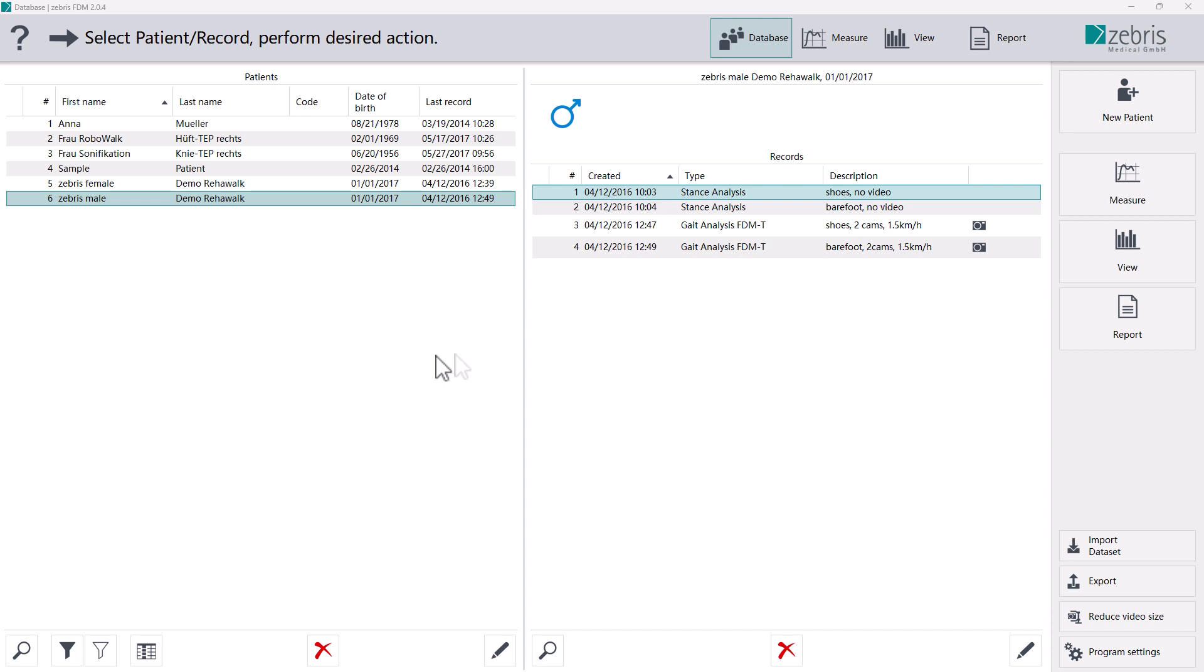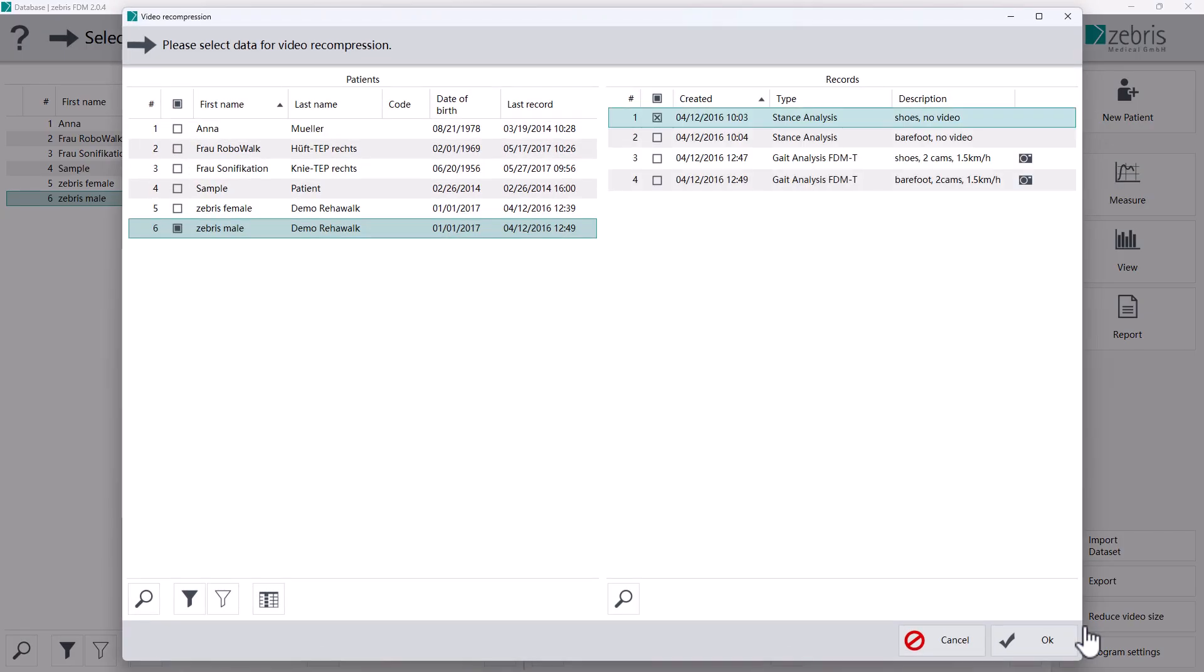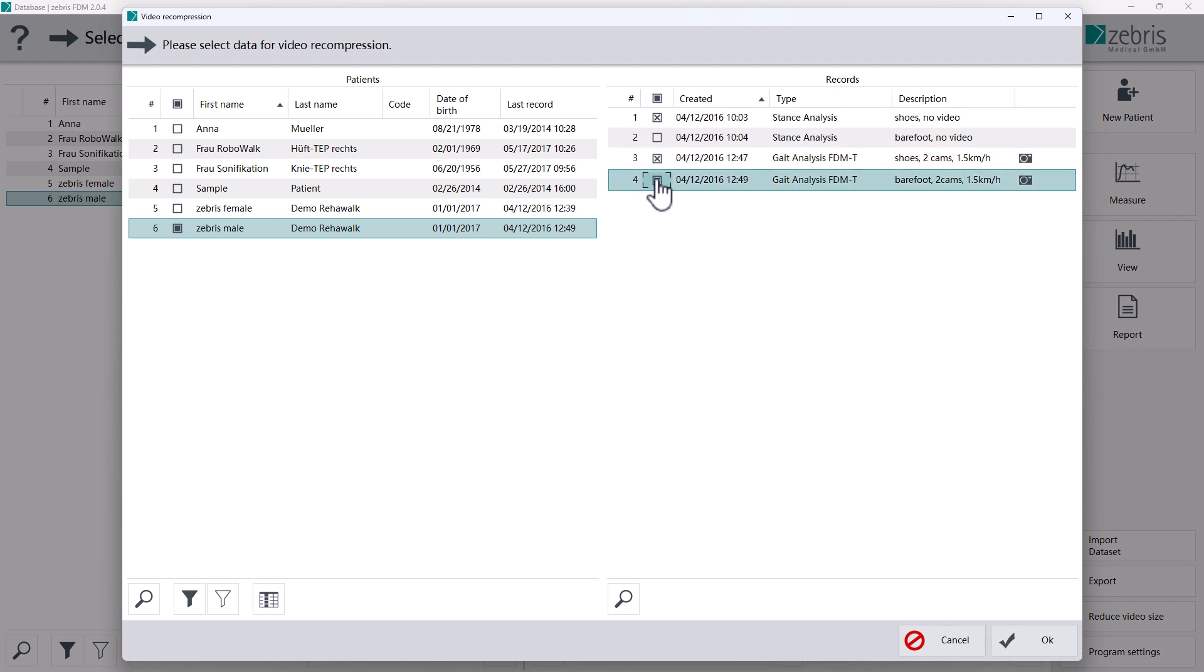Already saved records can be compressed manually using the reduce video file size button at the bottom right. A new window opens. In this window you can select all the data for which you want to compress the video data.